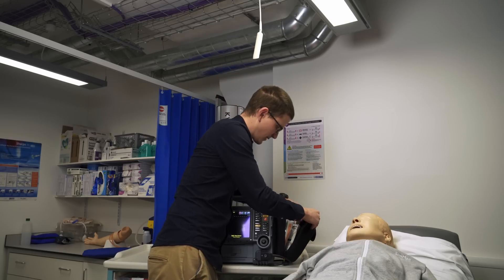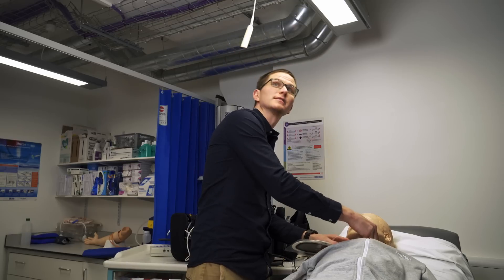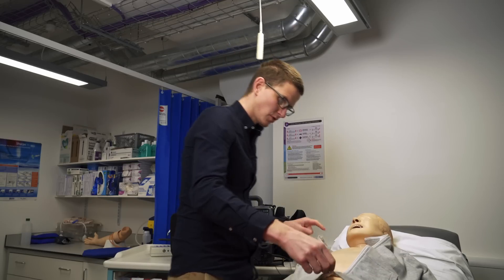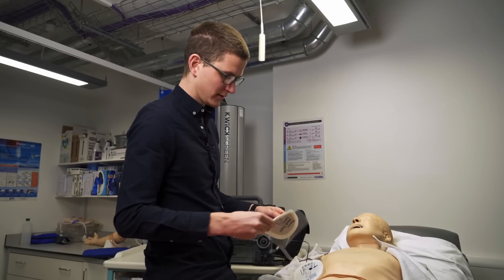So what do we need? The only thing you really need is pads. Obviously some consent is needed, and our pads or paddles, if that's what you have.